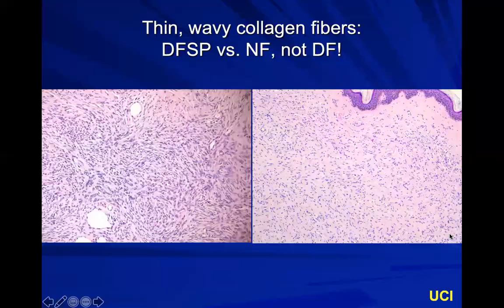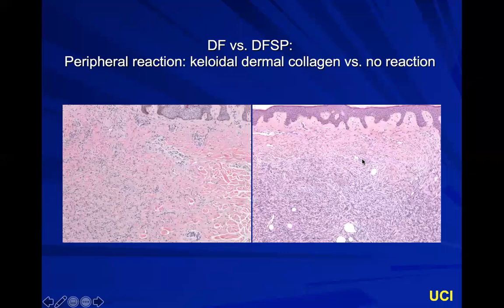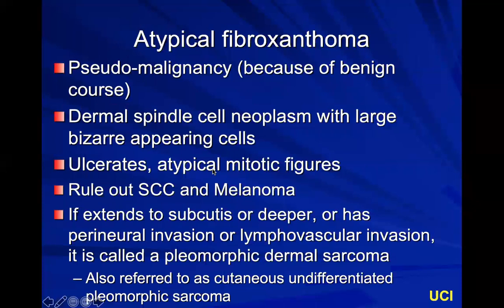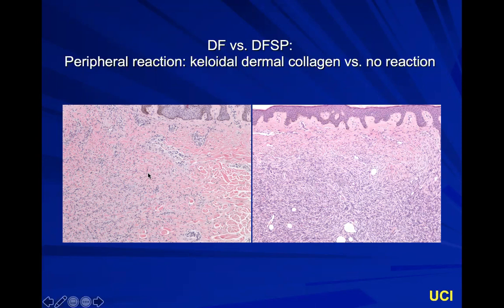These wavy cells can be hard to distinguish from something neural. The key difference from a dermatofibroma (DF): in DF you get keloidal collagen trapping, whereas DFSP just runs off the edge without that reaction. The tissue reaction in DF is protective — it holds the tumor in place. In DFSP, which is more like cancer, it's invisible. The cells in DF are more stellate; DFSP has this cellular uniform wavy growth without the grabbing keloidal collagen.